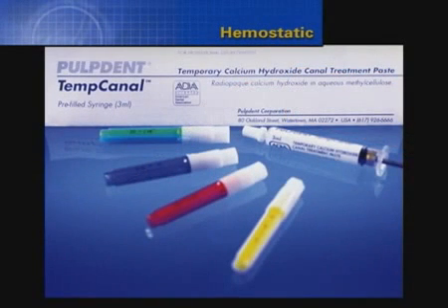Many perforation defects exhibit massive bleeding upon re-entry. Calcium hydroxide, a time-honored material, can be passively syringed into the canal, hydraulically moved into place, and allowed to remain in the canal defect for 4 to 5 minutes or longer. Calcium hydroxide is then flushed from the field using sodium hypochlorite. Two or three applications of placing and then removing calcium hydroxide usually begin to control bleeding.